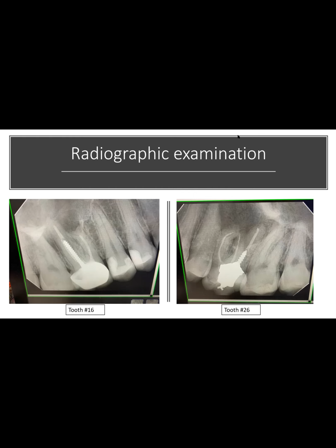So a patient came to see me. I looked at the PAs, and how are we going to do that? Can we pick on someone, Dr. Sally? Is that allowed? You can pick. I can't really move my mouse because then I might click on the wrong thing. Who should we pick on? Should we pick on Dr. Ali first? Sure. So Dr. Ali, can you describe what you see, please?